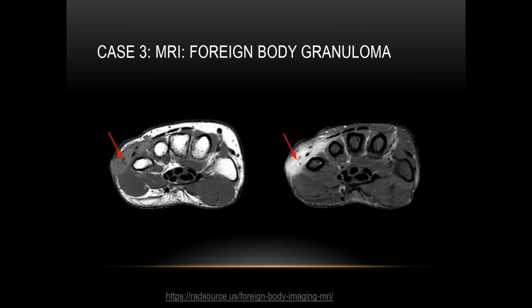This third case illustrates pre- and post-contrast images. You can see the linear low signal intensity foreign body indicated by the red arrows with surrounding enhancement. Without a known history of foreign body, this could be interpreted as a soft tissue mass — so it is important to maintain a high level of suspicion in the extremities for possible foreign body.